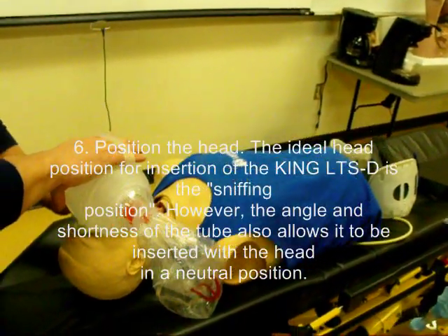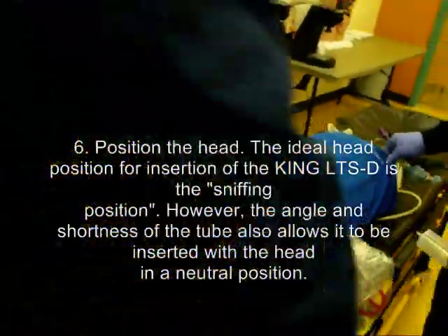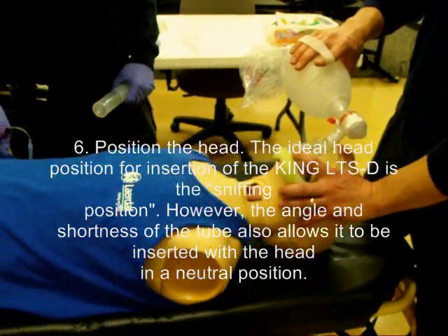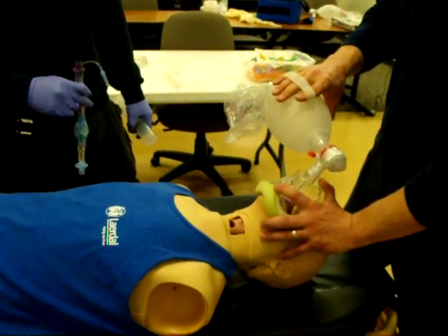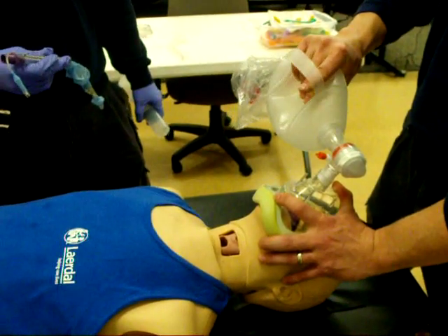Position the head. The ideal head position for the insertion of the King airway is the sniffing position. However, the angle and shortness of the tube also allows it to be inserted with the head in a neutral position if C-spine precautions are an issue.